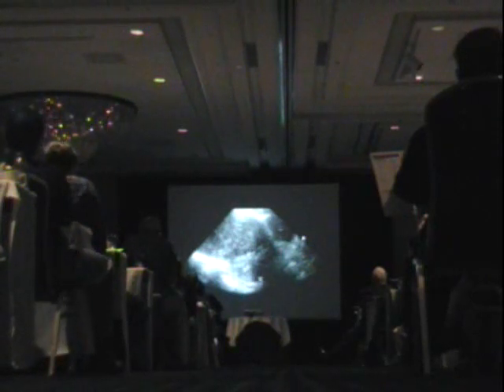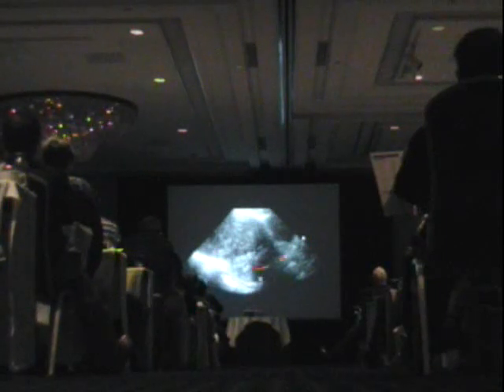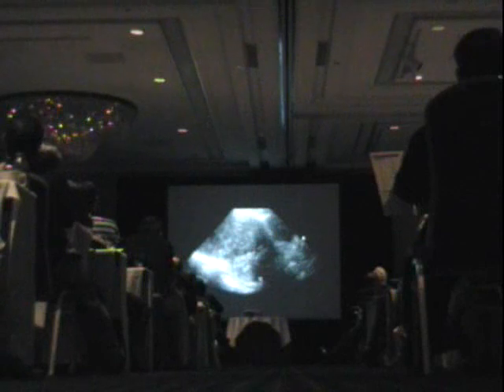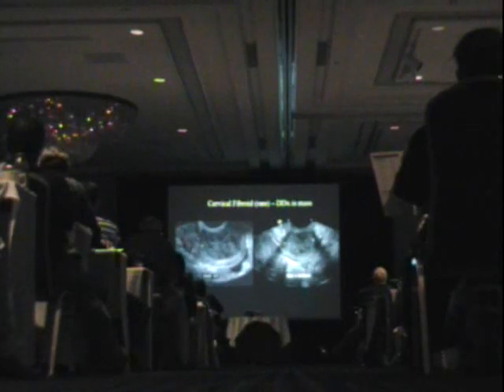And when you get to fibroids of this size, a transvaginal exam obviously isn't going to help, because the vaginal probe, which only penetrates 5 or 6 centimeters, is never ever going to find this fibroid. So you always need to start imaging of the uterus with a look from on top to see if you've got one of these big, big fibroid uteri.